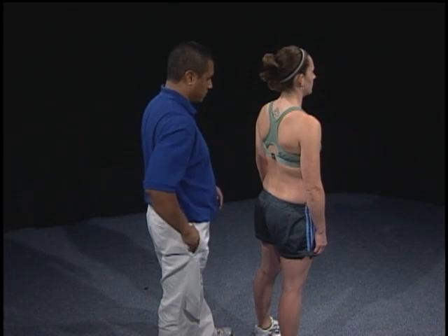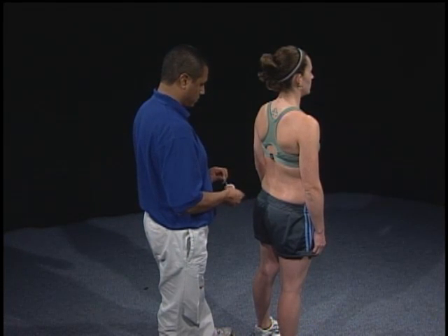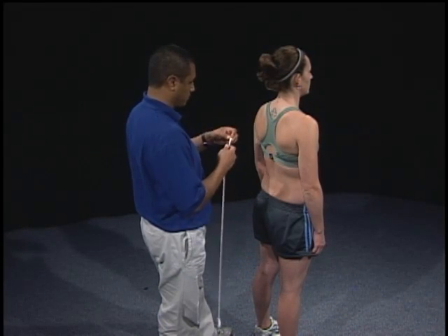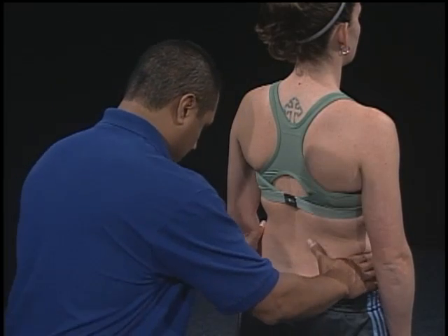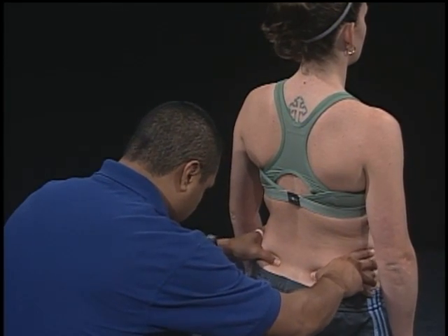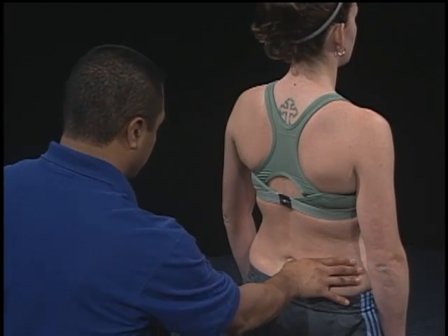You are now ready to measure the joint range of motion. Make sure you expose the bony landmarks you will be using. For this measurement, you will be using a flexible tape measure to record measurements. Use a skin marking pencil to mark the spinous processes of C7 and S1. Recall the technique taught in class to find C7 and S1.